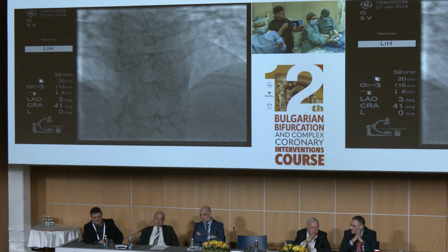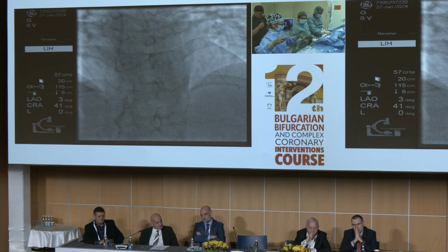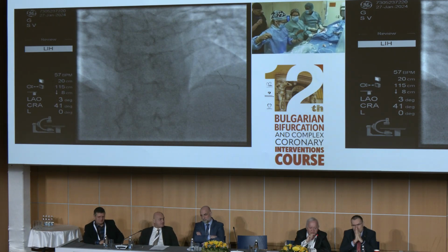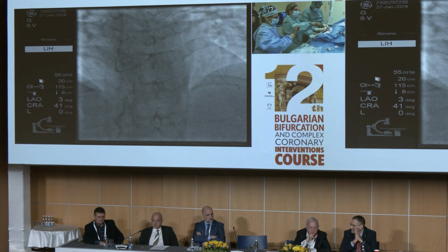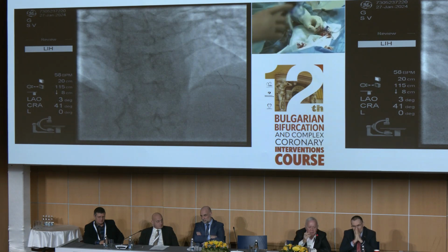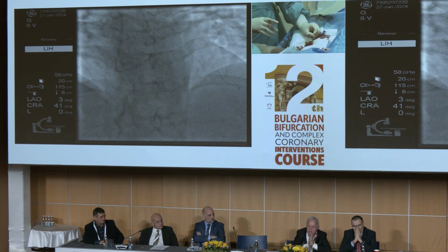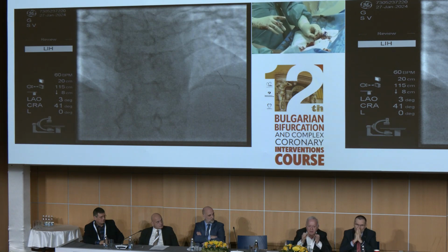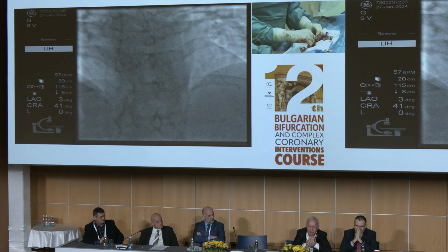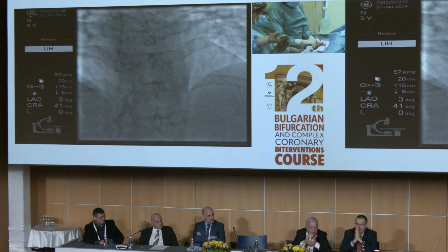Is it non-compliant? How to get 3.8 millimeter? Well, 3.5. 3.8? 26 atmospheres. Whoa. That's why you use a high pressure non-compliant balloon for a pot. We see that in literature, in meetings. This is crazy, because this is not giving you precise diameter. So you choose a semi-compliant balloon, you look at the chart and you put the pressure necessary to reach 3.8. This is what we have to do.